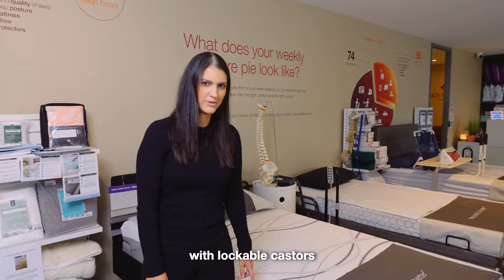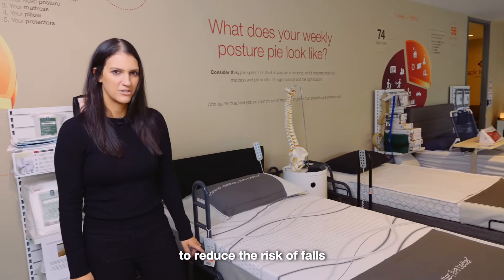The bed is easy to move with lockable casters. It also has a low height to reduce the risk of falls.